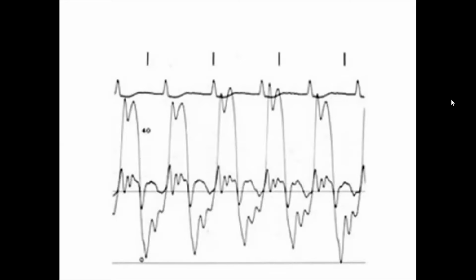And there is the diastolic gradient between the RA and the RV. Which pressure is higher here in the diastole, the right atrial or the RV pressure? The atrial pressure.